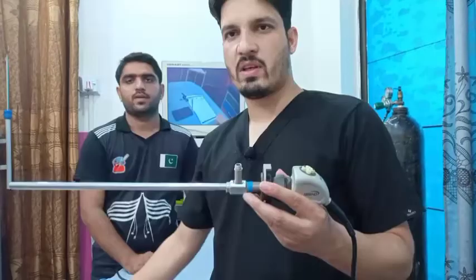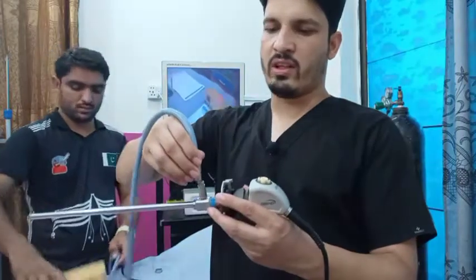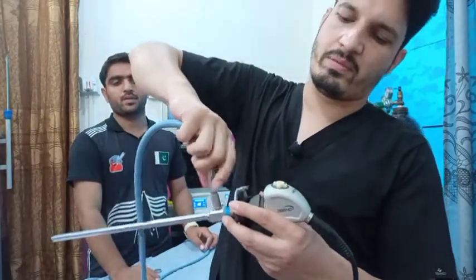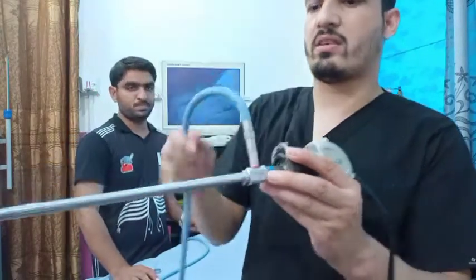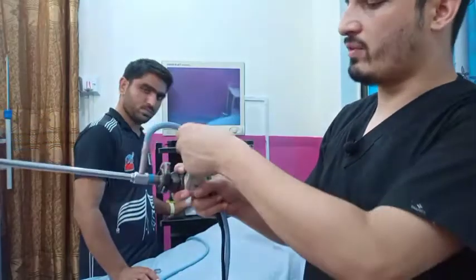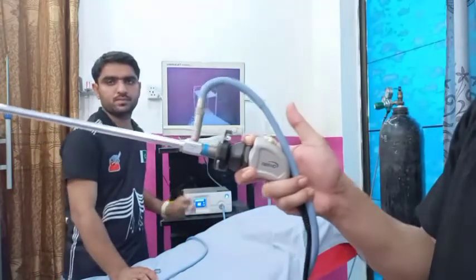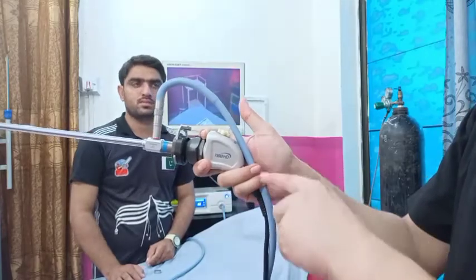Very gently you will take the light cable here into the light adapter, very gently, like this. After that you will hold it like this — there should be a gap between your two fingers, and your thumb should be free.